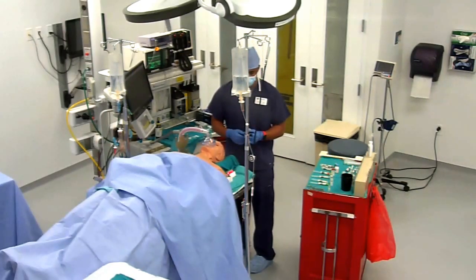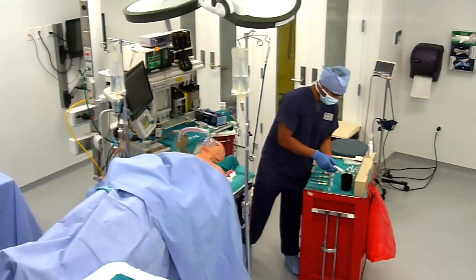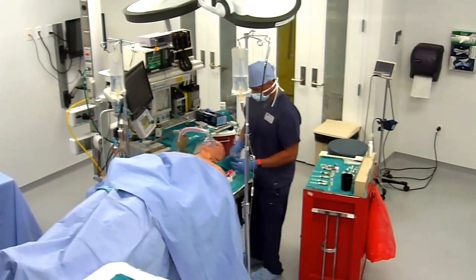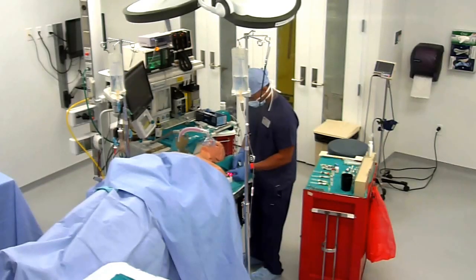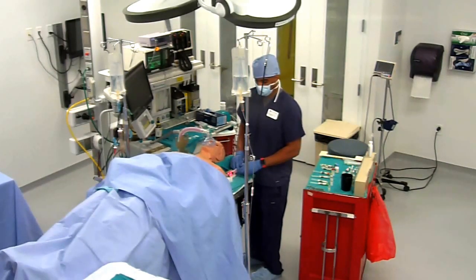And propofol is 1 to 2.5 milligrams per kilogram. She's 70 kilograms. Because we can always give more, I'm gonna start with 1 and assess. So 70 milligrams, 7 mils, 1 milligram per kilogram. Propofol. How many milligrams are you saying? 7 mils, 70 milligrams for 1 to 1. The range being 1 to 2.5 milligrams per kilogram. And just to add in here, you wouldn't really squirt out propofol because you may need to give the rest of it later on. Yes. Okay, go ahead. Just to keep it simple for myself.